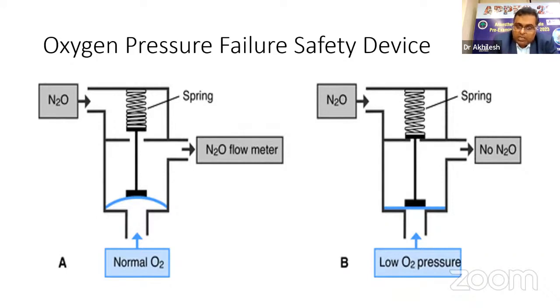Another way this system can be bypassed, there is a difficult kind of question which can be asked in the exams. Suppose you pressurize the system. You open up the cylinders, attach them, stop the flow meters, so the system gets pressurized. So this is there.